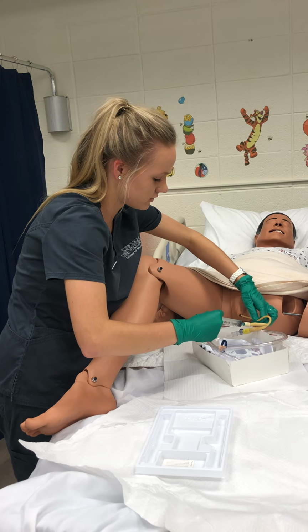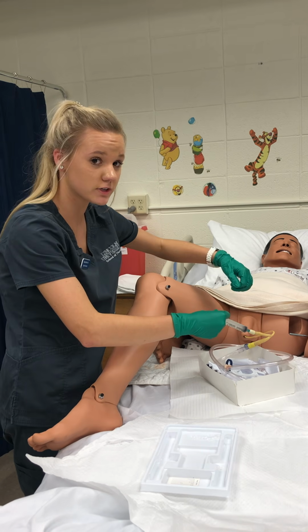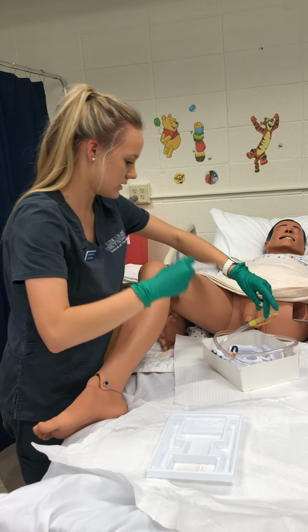I'm going to pull, make sure there's resistance. If my patient were to have pain when I was inserting it, I'd make sure to deflate the balloon and insert it 1 extra inch. So I'm going to go ahead and detach this and pitch this.